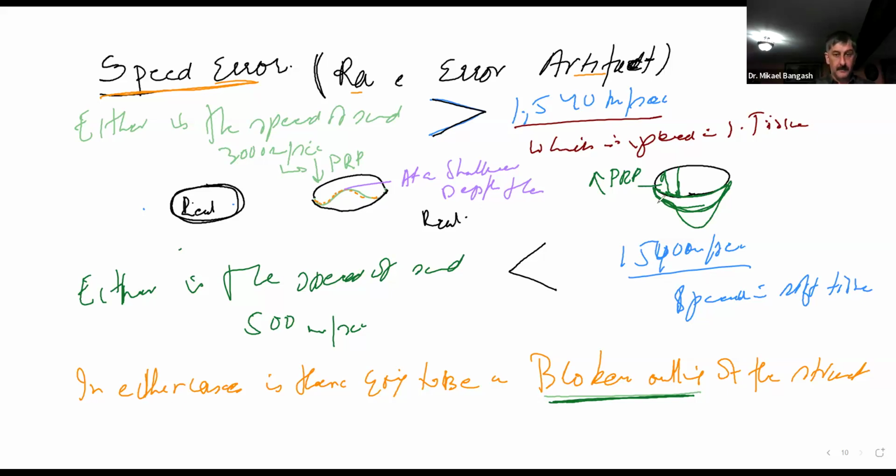Now please keep in mind, guys, that the echogenicity, which means the brightness of the reflections, is not changing. So this one here that may appear at a shallower depth is going to have the same echogenicity as the real structure, or as the real outline would have had.